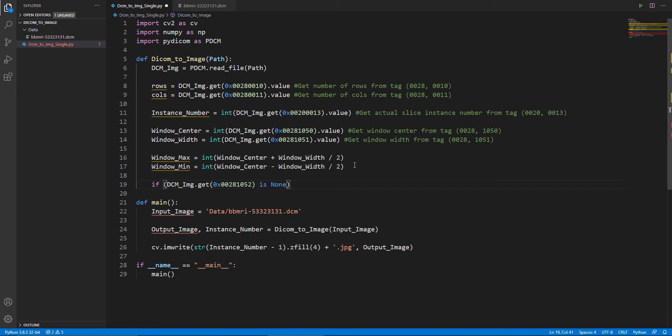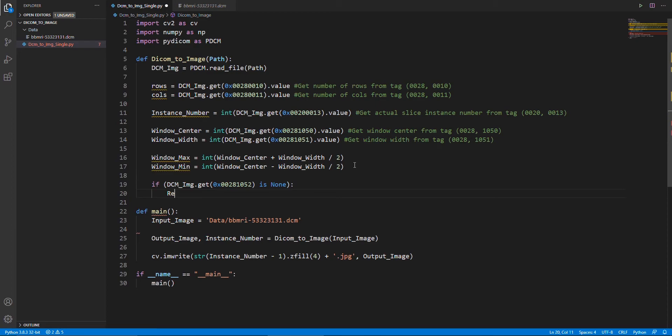After that, we will further get information about rescale intercept and rescale slope from the tags with the conditions shown here.